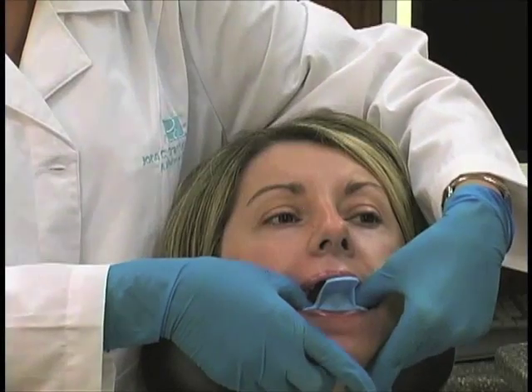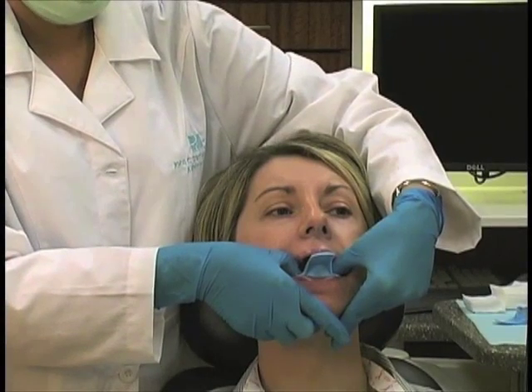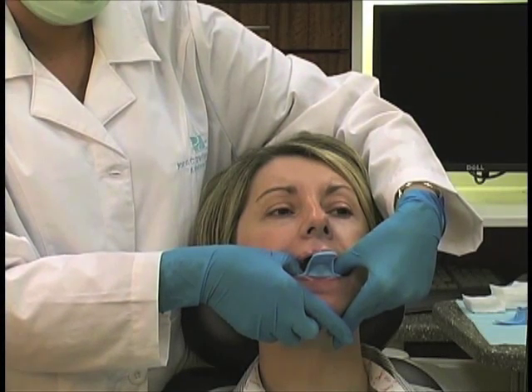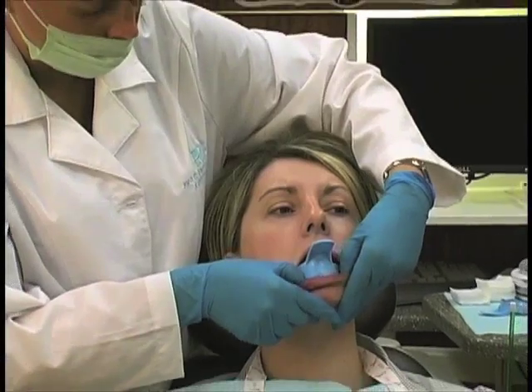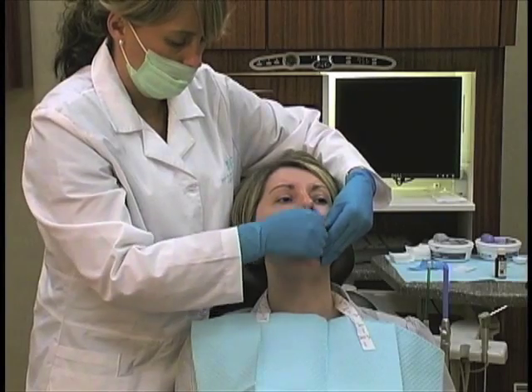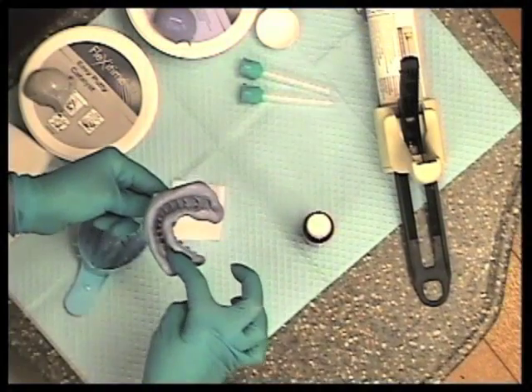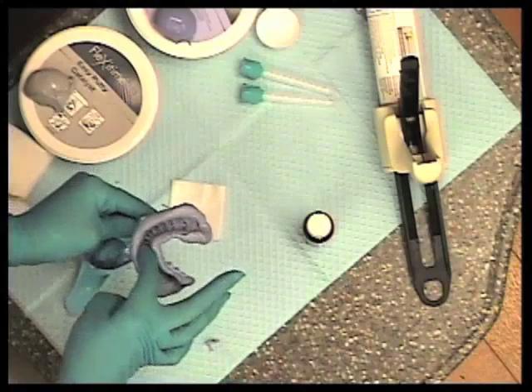And the density of this putty will displace the tissues really, really nicely, so you'll get all those land areas on the buccal and lingual. And then when Mariah feels like we've got that, not initial set, but a nice adaptation, what she's going to do is pull this out of the patient's mouth. And again, go back to the bracket table. And she's going to go ahead and squirt a wash of polyvinyl material, a polyvinyl wash, right into it.